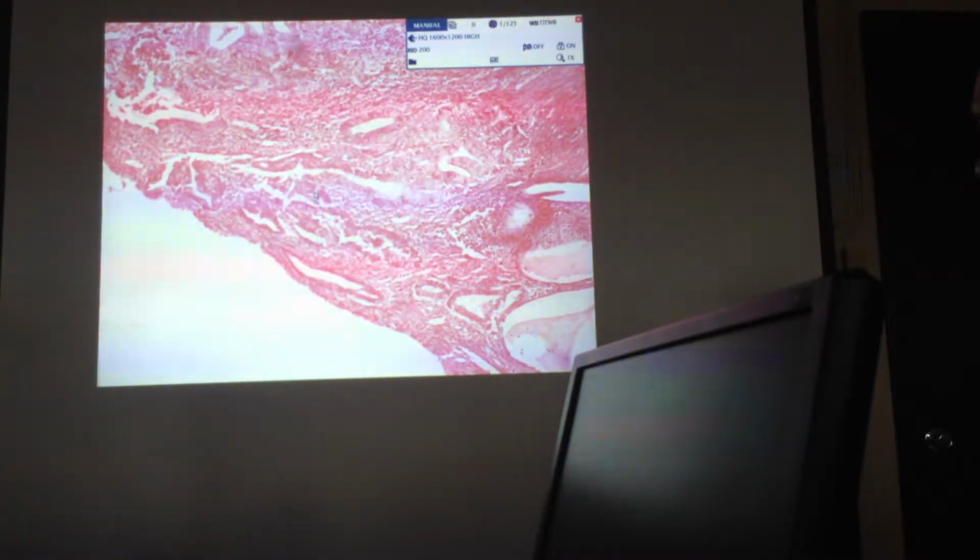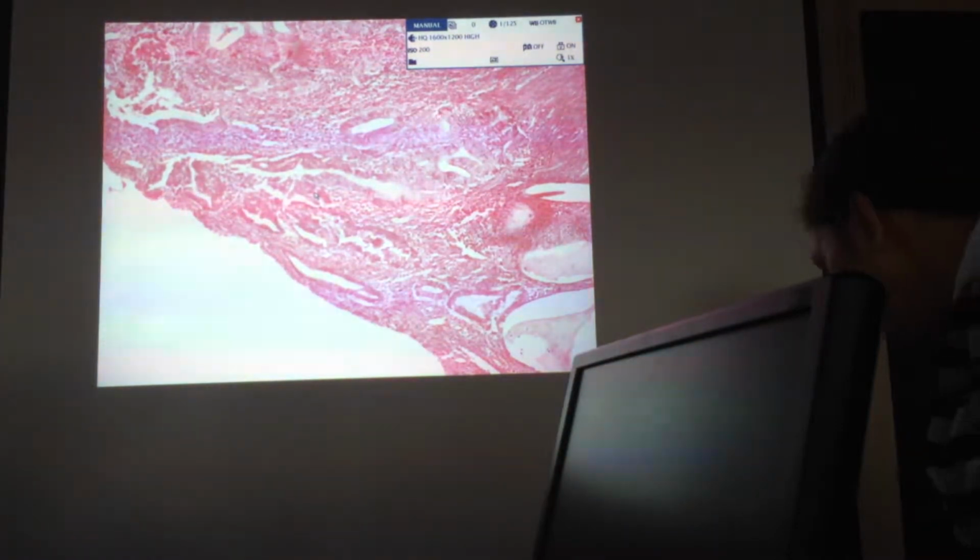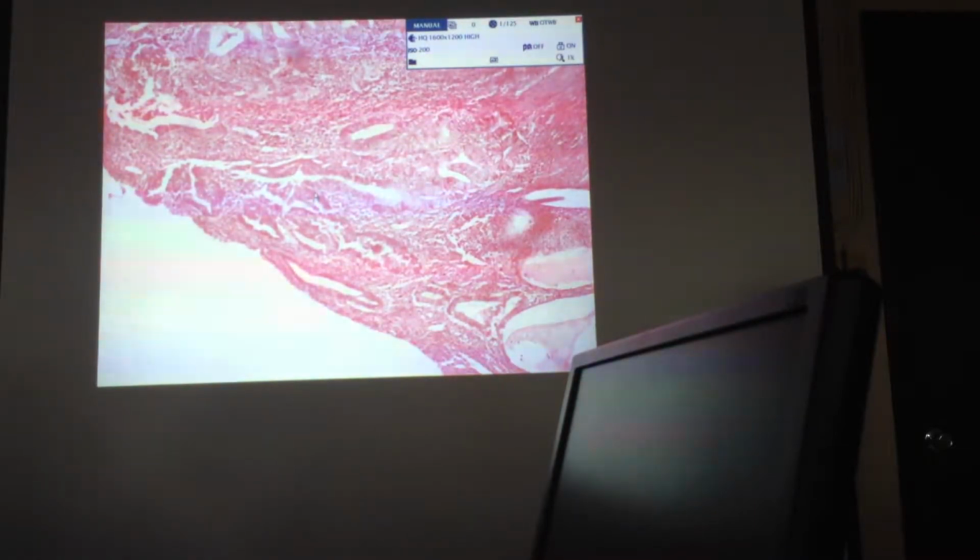And usually the endometrioid adenocarcinoma, this one would be seen in the perimenopausal and menopausal. The ones with the poor prognosis are not the endometrioid, but the clear cell type, okay, of adenocarcinoma, which would be seen in the elderly individuals. Okay. Again, this is the appearance. We are seeing back-to-back formations. So, adenocarcinoma.